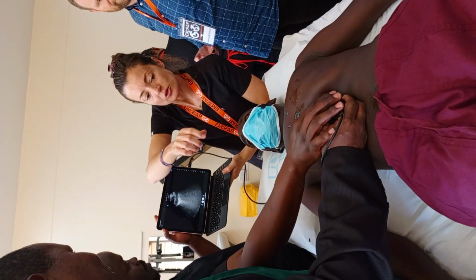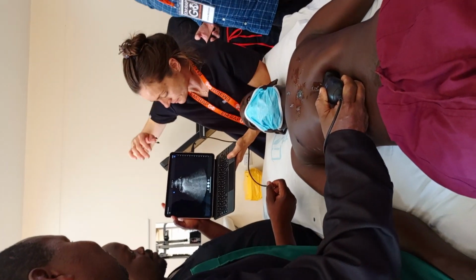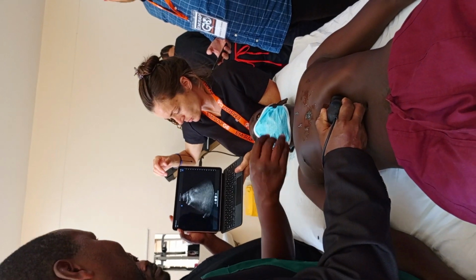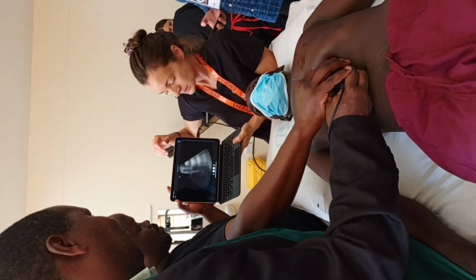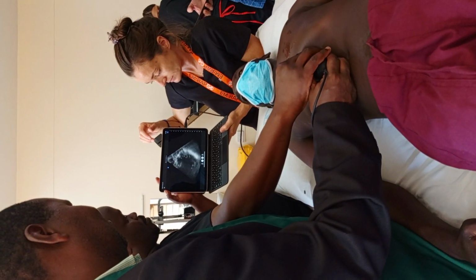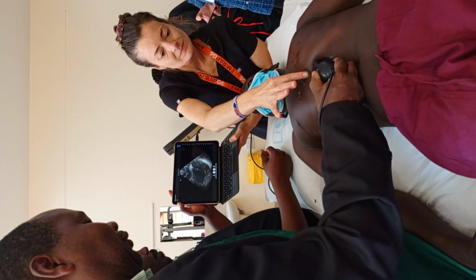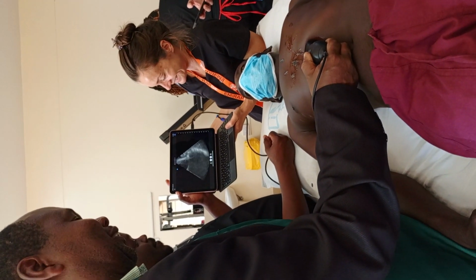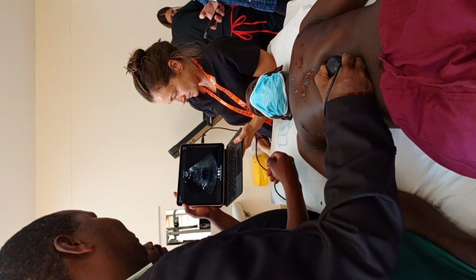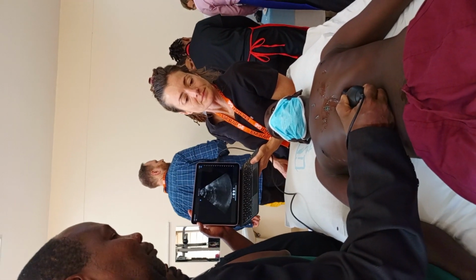So this is the scoop, and remember, where's our heart? It's right here. Maybe a little bit more gel for us. We need a little bit more gel. There we go. Beautiful. Okay, left upper quadrant.